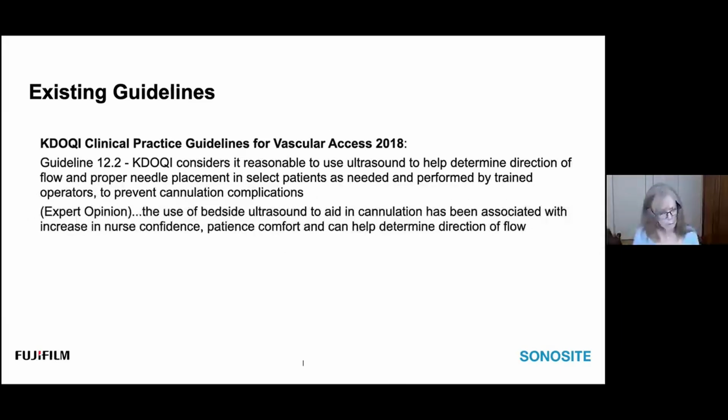Often when we perform any kind of nursing task, it is prudent for us to understand the best practice guidelines that can back up those tasks we perform. As it relates to ultrasound-guided cannulation, in truth, there are limited guidelines to support the use of it. But that's just because it's fairly new in our industry and it's something that's building up momentum. If we were to look at, for example, the KDOQI guidelines for clinical practice related to vascular access. These guidelines are dated 2018, but correct me if I'm wrong, I think the publication of these guidelines just came out this past April 2020.